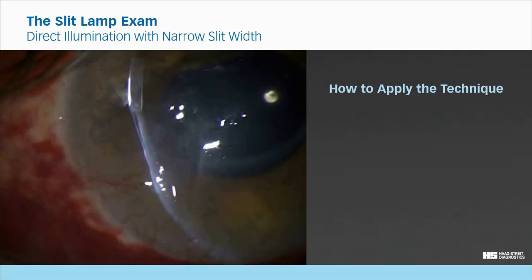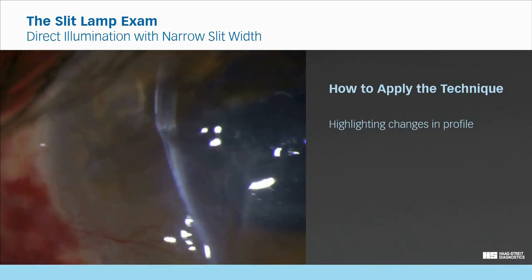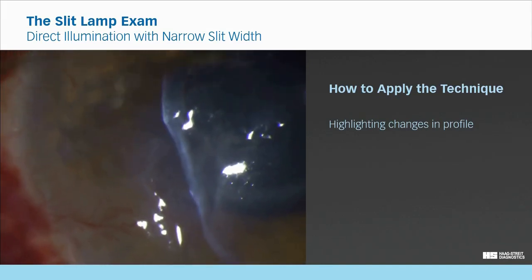For the evaluation of changes in profile in a given structure, bring the slit lamp in focus and choose a large illumination angle. The larger the illumination angle is, the better you see changes in profile.